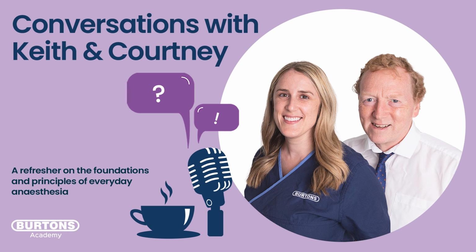Absolutely. So what I've described previously, we talked about phase 3 and how it led into phase 0, and that's a very neat concept. But bear in mind that when patients breathe out, they don't automatically start breathing in again. So we'll breathe out, then there's a pause, and then we breathe in. That expiratory pause, what happens in the expiratory pause? That's a very, very interesting thing, and a lot of factors would determine what you see on the capnogram. But let's just take a very simple example.